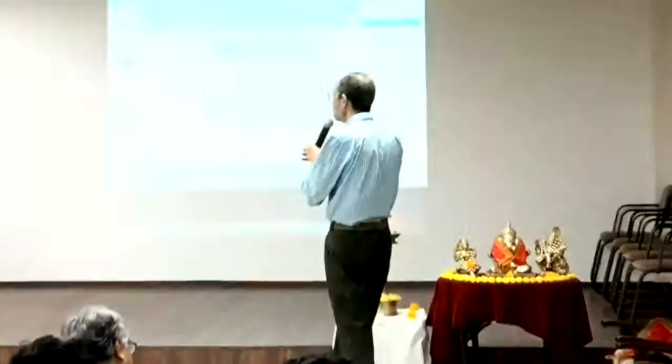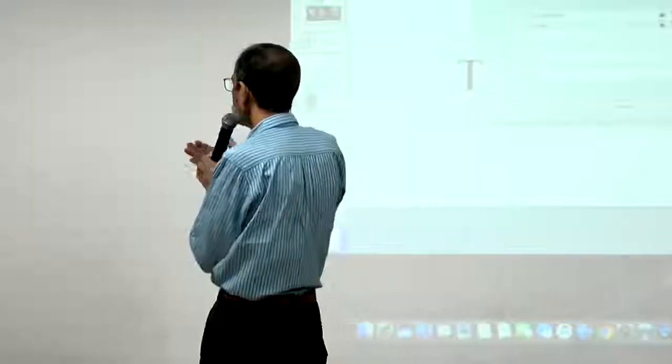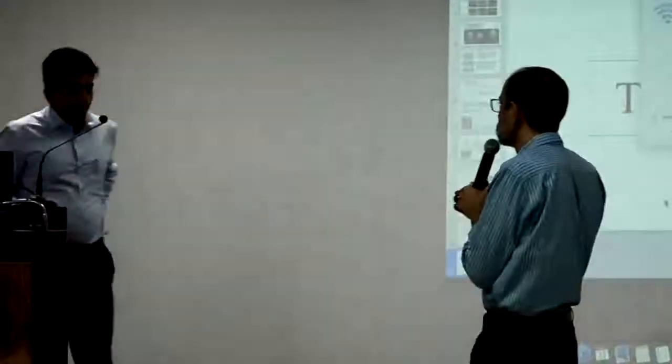Thank you, Pradip. So, as a general matter, in all the patients that you treat, what is your use of fixators? Out of 100 patients with an unstable pelvis, how many do you use fixators in? It depends, because we generally get patients that are already stabilized. By the time the patient reaches the center part of the city, the patient has either succumbed to the injury or is stable.